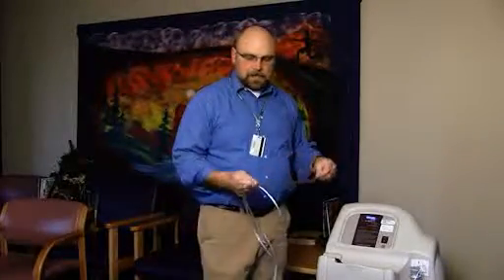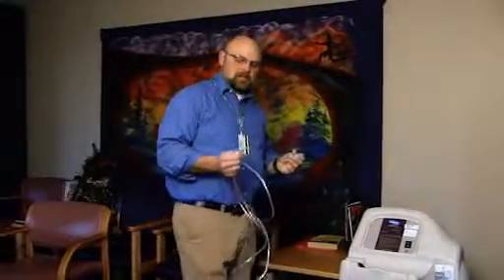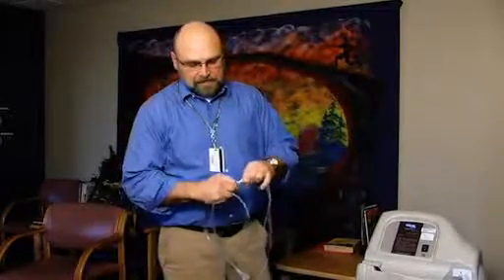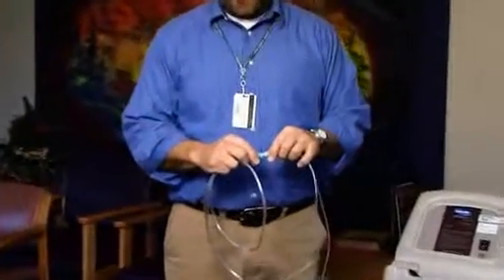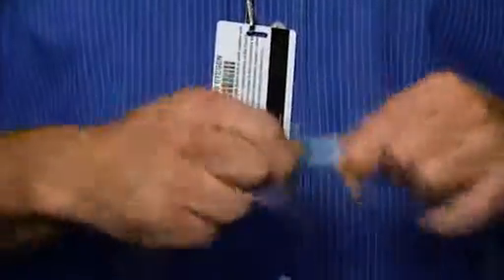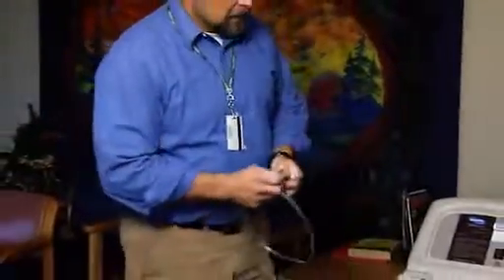The cannula, the nose piece, we want to do that because it's personal and it's touching your face. You want to throw that away on a weekly basis. And simply what you're going to do is disconnect, and lots of times these things get pushed in kind of hard, so the way that you're going to disconnect is it's kind of a wiggle thing. So you wiggle it and it comes loose versus pulling it apart. So this is monthly and this is weekly.